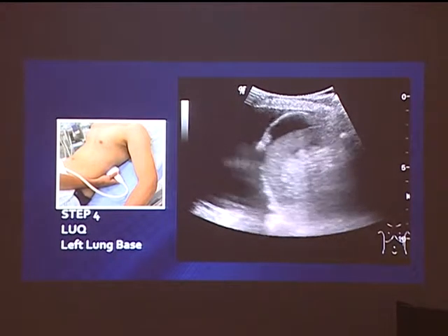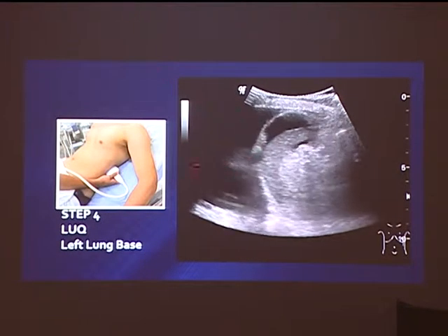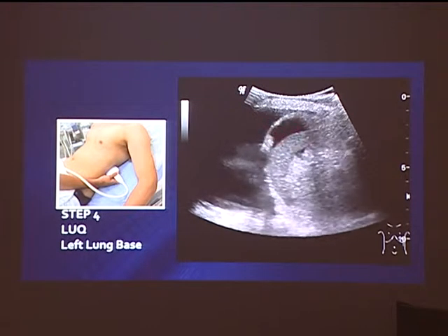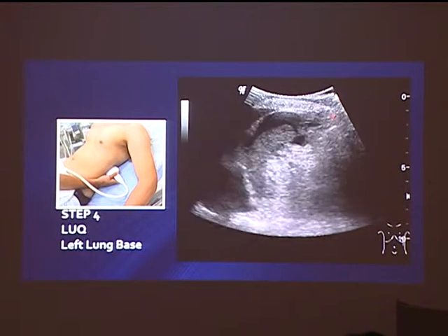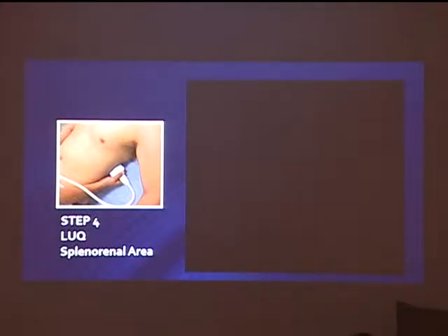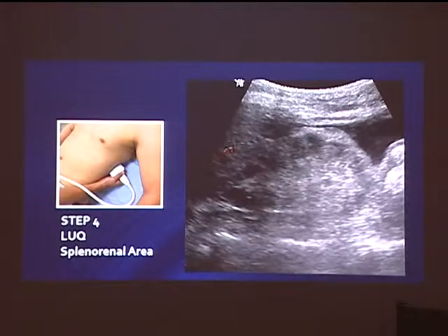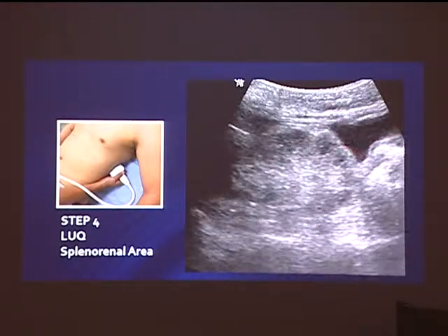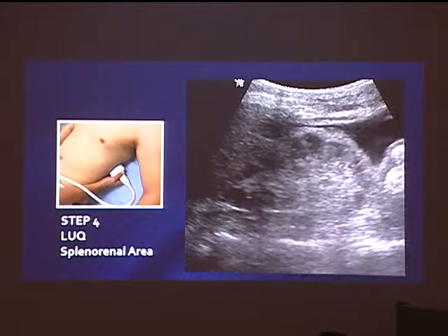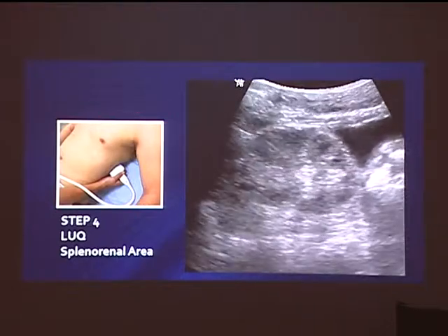Another patient who suffered a road traffic accident has both findings: there's no curtain sign because the lung has been pushed to one side — hemothorax. But there's also something else: hemoperitoneum. The spleen is surrounded by fluid. So he has both hemothorax and hemoperitoneum. Scanning further down: you can see fluid at the inferior pole of the kidney. Just a reminder — you must scan thoroughly, because sometimes you don't see fluid in one place but there's a collection somewhere else.